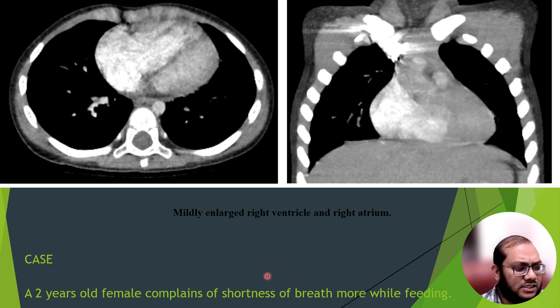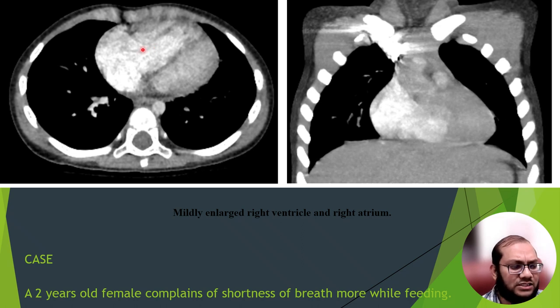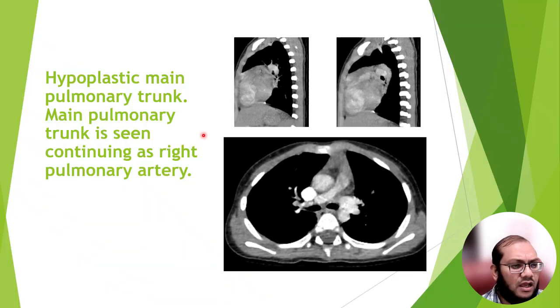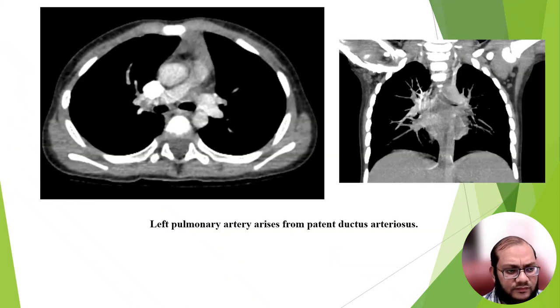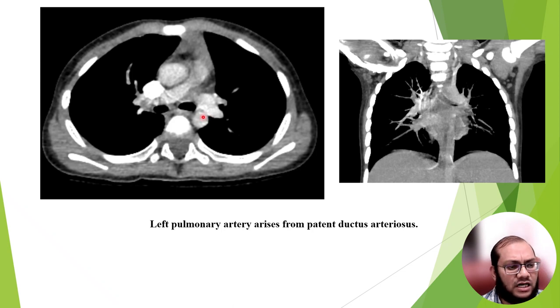In this case, a 2-year-old female presented with complaints of shortness of breath, more while feeding. Here we can see the right atrium and the right ventricle are mildly enlarged. The main pulmonary trunk is also hypoplastic and it continues as the right pulmonary artery. The left pulmonary artery arises from a patent ductus arteriosus.